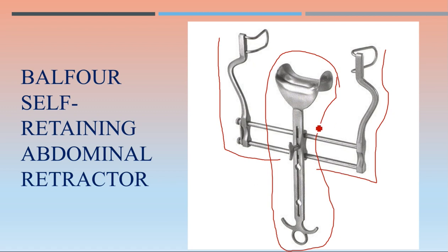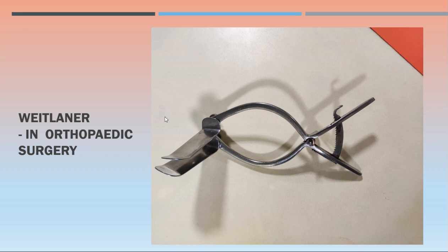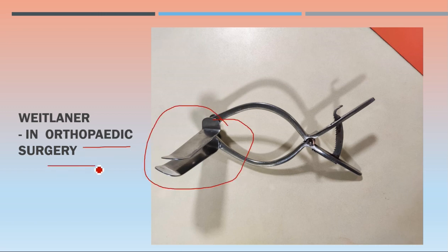If you see just the blade alone, don't be confused — it is the blade part of the Balfour self-retaining abdominal retractor. Then the Weitlaner self-retaining retractor — it has long blades and is commonly used in orthopedic surgery for retracting tissues. Force can be applied and you can see the lock system.